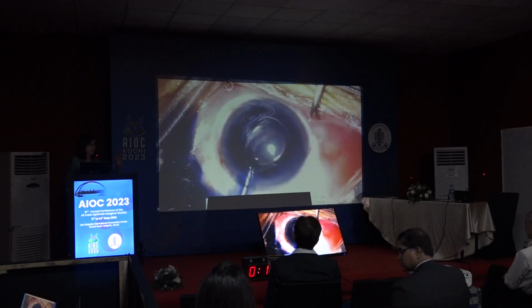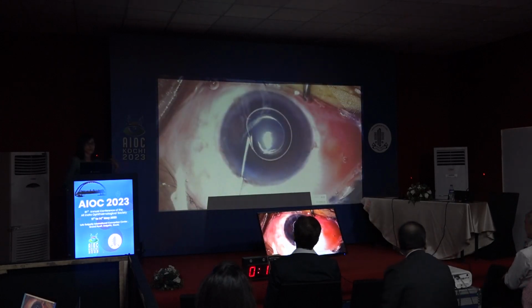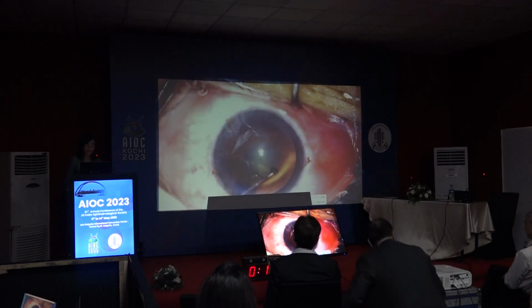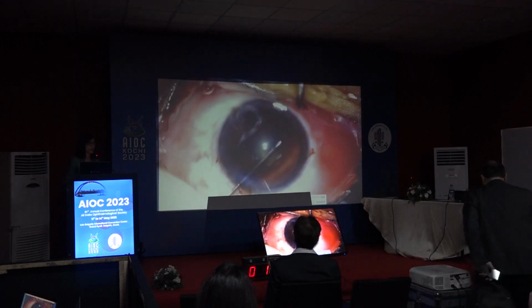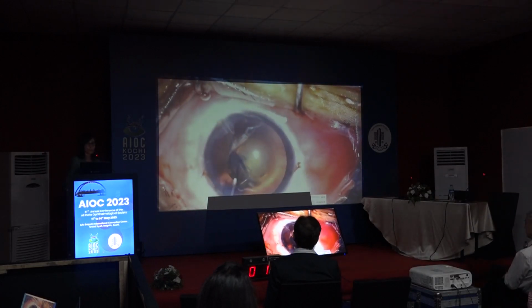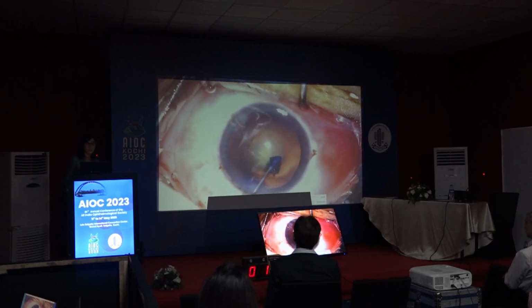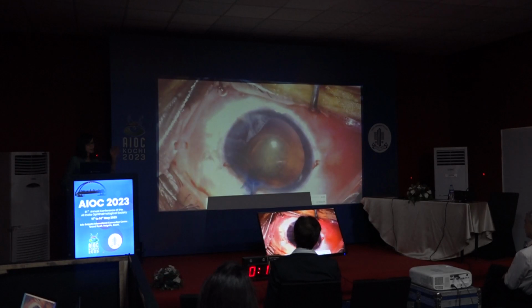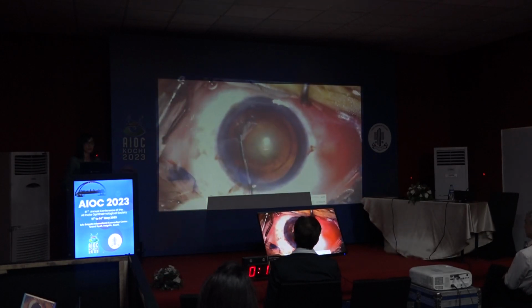A gentle wash, a gentle injection of blue dye. You don't want to inject too much. You don't want the pupil going down. With viscoelastic in the eye, then you plan a capsulotomy. We all know that we plan a rhexis, which should be about 5 millimeters, not more, for the possibility of a sulcus placement. Having completed your rhexis, very little depression. I try and maintain my anterior chamber always at the correct optimal depth.